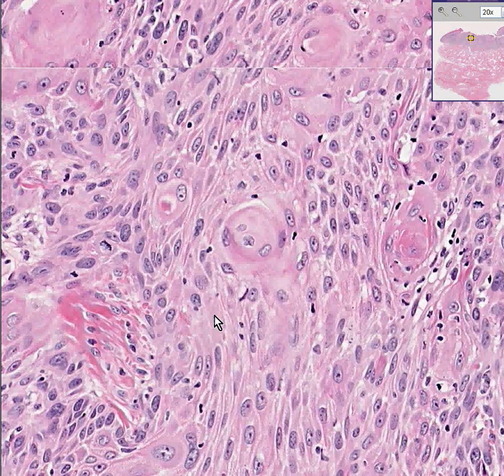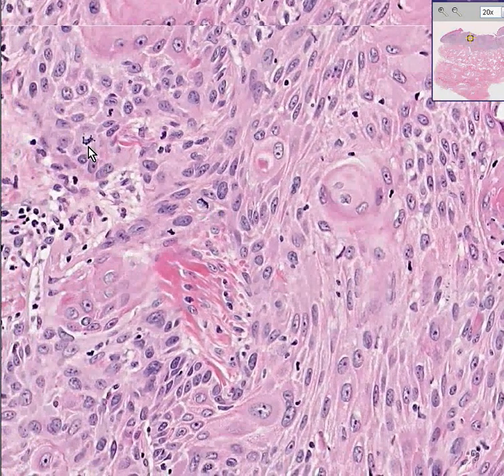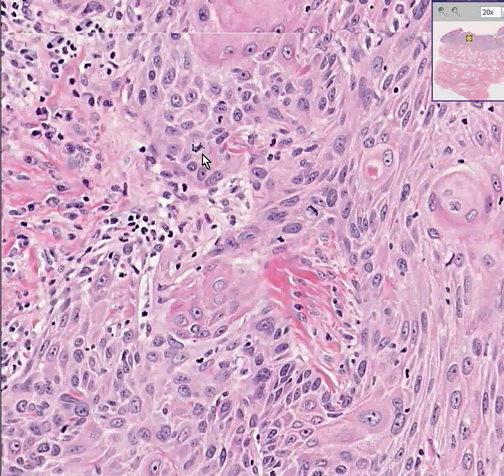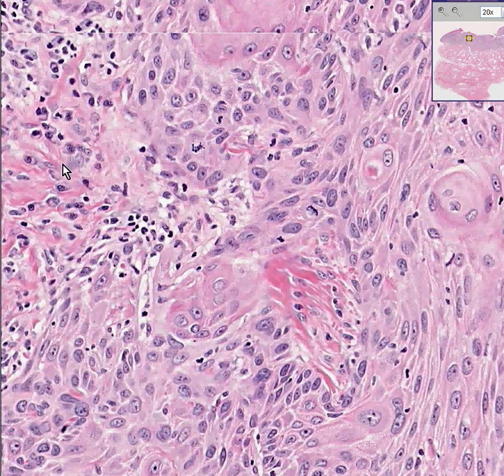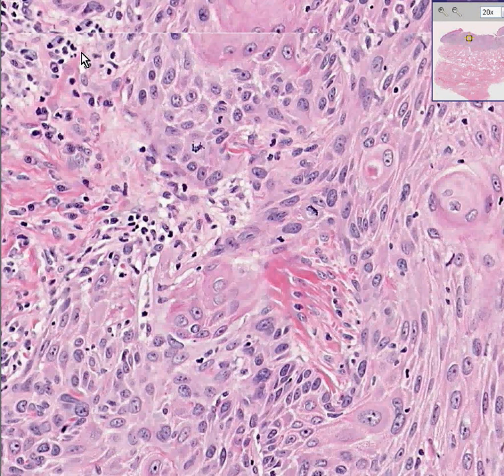Notice we have all the other features of malignancy: big cells, multiple nucleoli, increased mitosis, and abnormal mitosis. We probably have all the other features of squamous cell carcinoma. Notice how this red material within the squamous cells may actually be keratin that the tumor is making. Because it's keratin made by cancer cells rather than normal cells, this process is often called dyskeratosis.